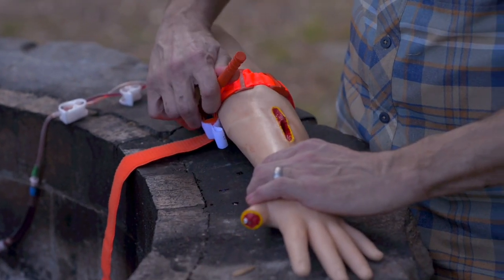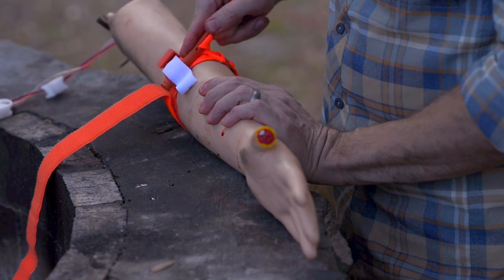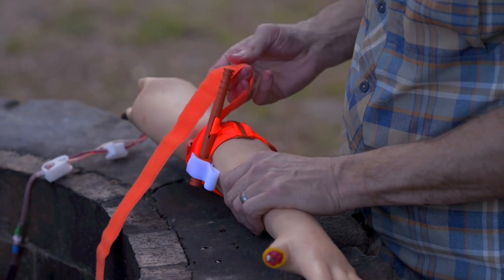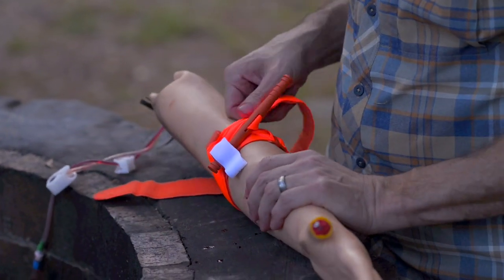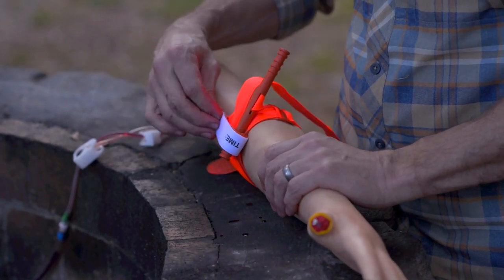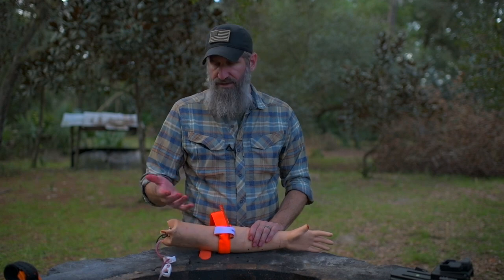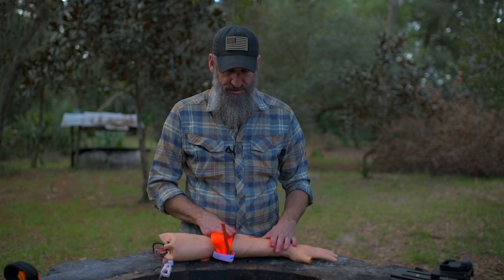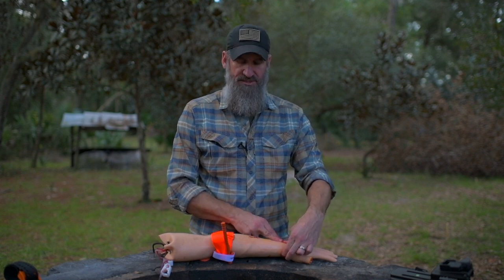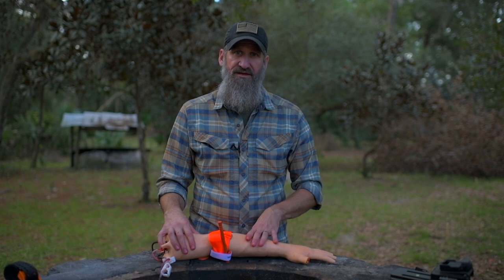If you still have a radial pulse, give the windlass one or two more turns. Once tightened, secure the windlass by dropping it into the keeper. With a CAT tourniquet, tuck the tail inside and wrap it around to keep it from catching on something and loosening. Use the tab to close the cover. Annotate the time you placed the tourniquet using the marker provided. Reassess every 10 minutes to confirm it's effectively controlling the bleed.